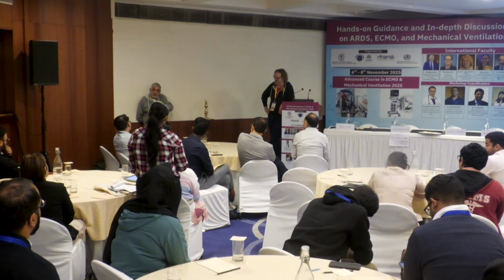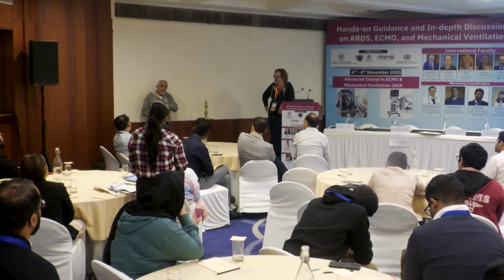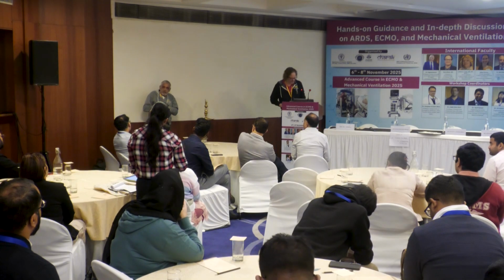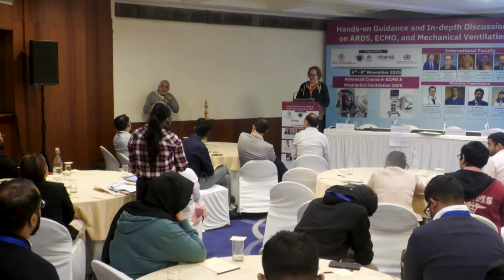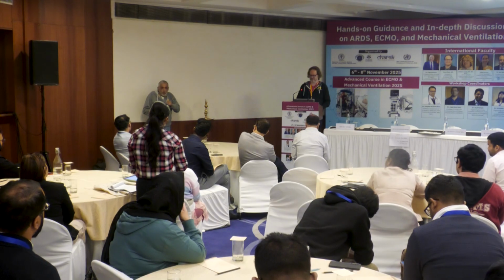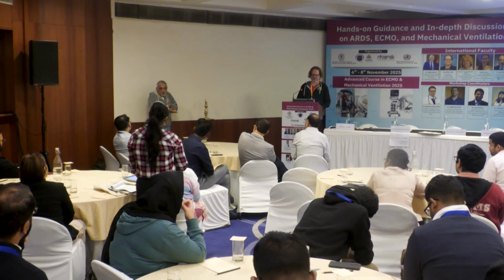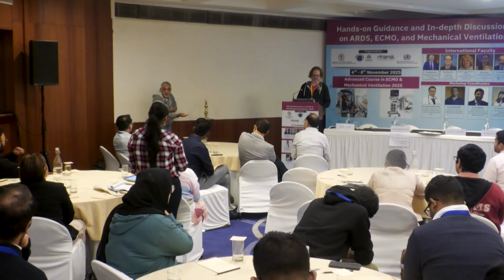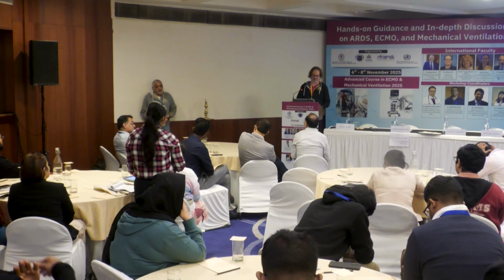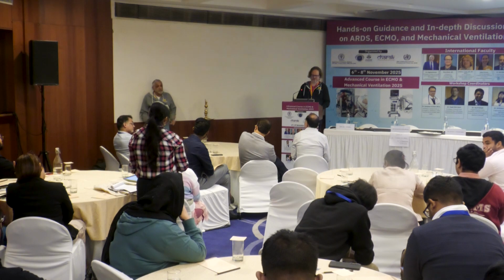Once it comes straight down, you are advancing your catheter, but you have to be at the right stage where you are taking the guide wire out and the catheter goes into the vena cava. Otherwise, the guide wire comes out a little bit, and next thing you know, the catheter does that. Once it does that, you are sort of stuck.